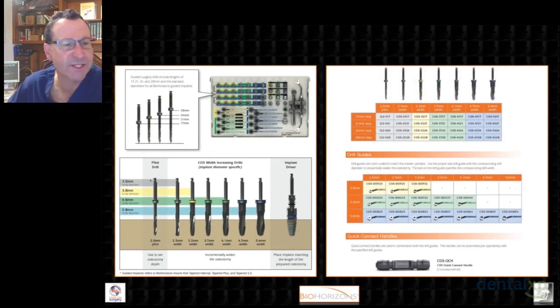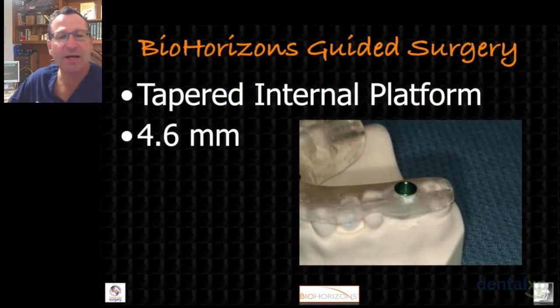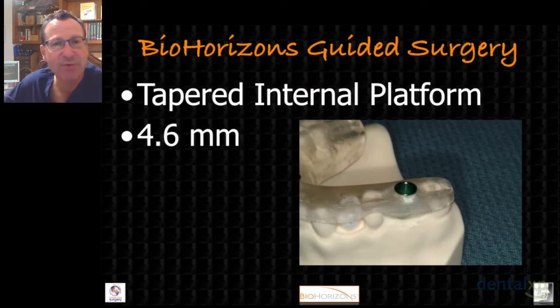For the 3.0 implant system, we just have 2 drills. For the 4.6, you're using 5, and for the 5.8 diameter, that goes up to 7 drills used altogether, although we're tending to skip a couple of the drills in the middle in the office, and it's working out quite well. You can see on the implant driver we've got a number of position slots, and that is where the depth stop comes in handy, which I'll show you.